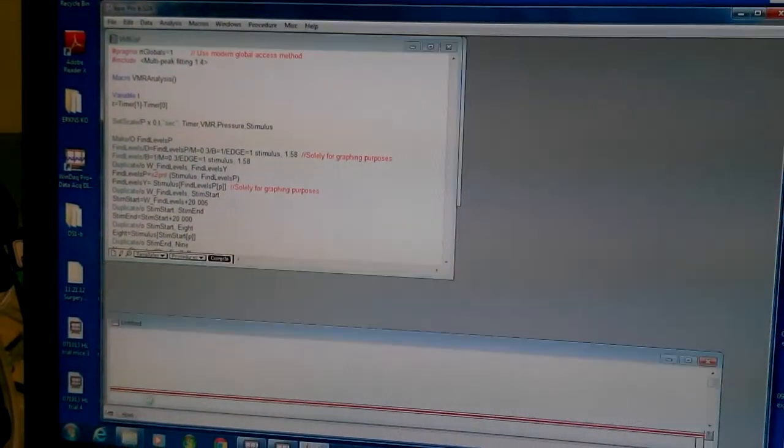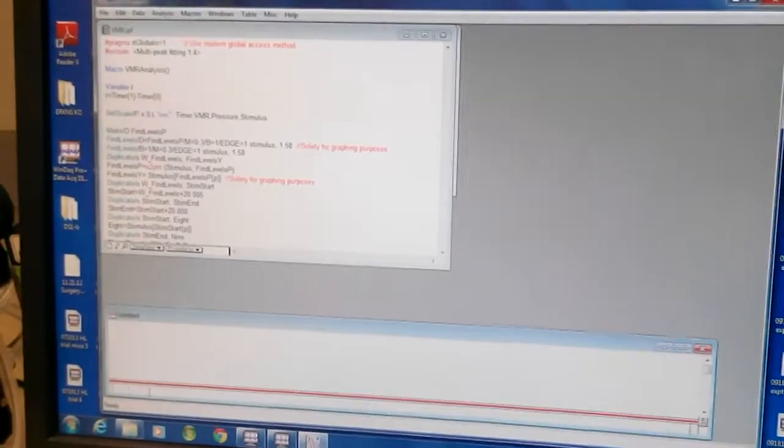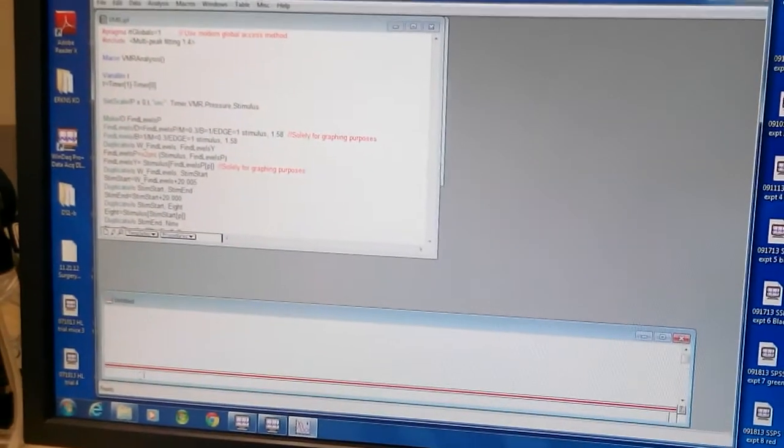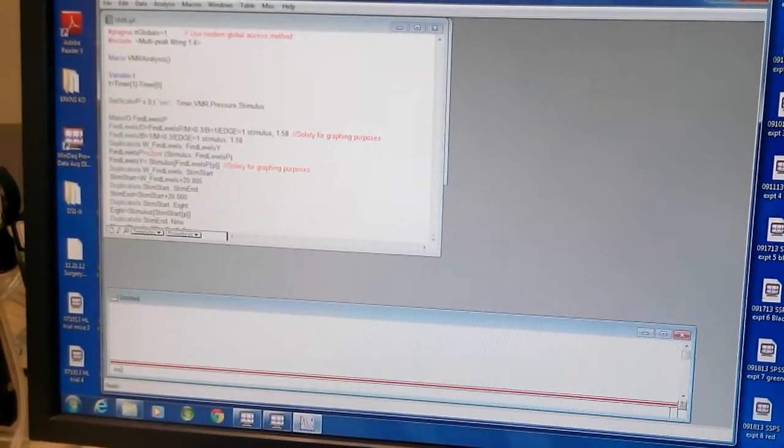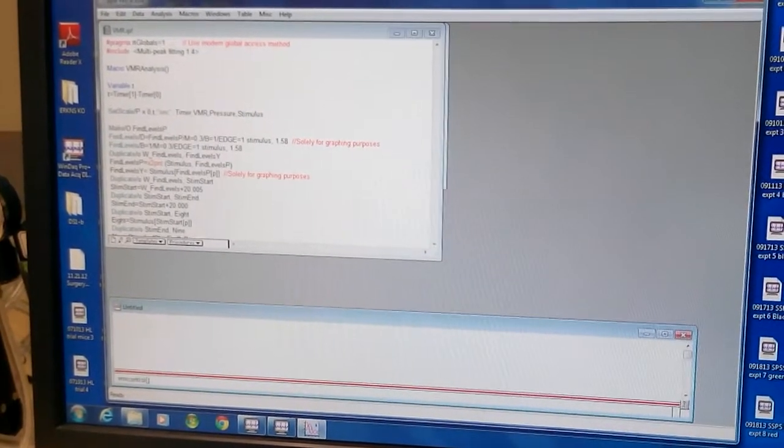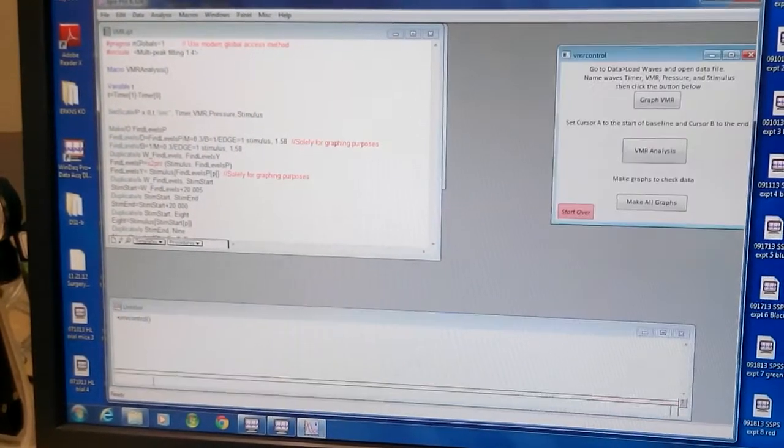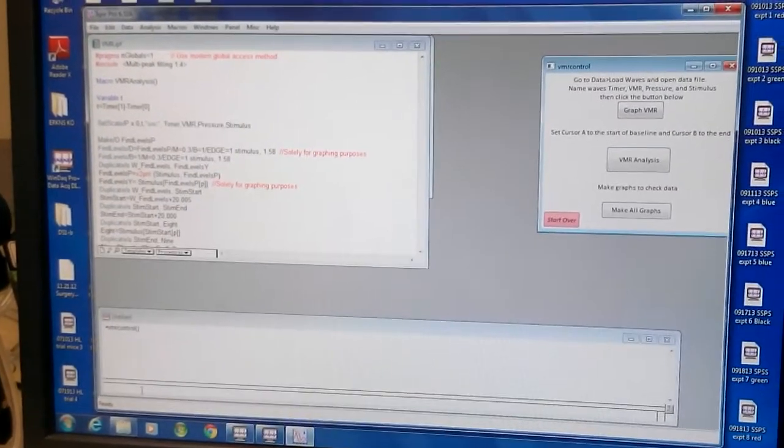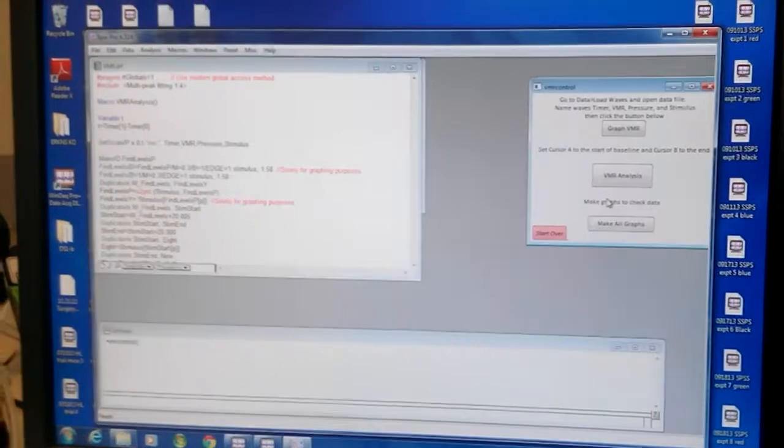At the bottom, you write VMR control. No space, nothing. And then you click enter.